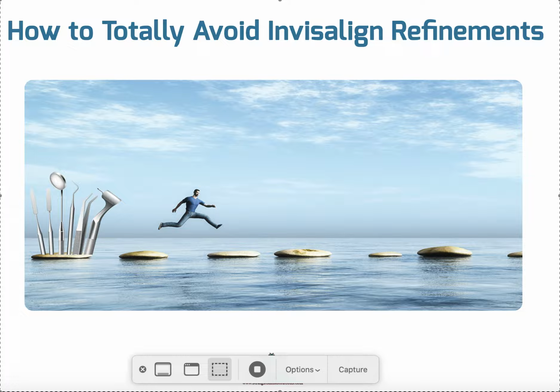And I use the same analogy with aligners, okay? So let me connect the dots here. The beauty of Invisalign Comprehensive or ClearCorrect Unlimited is that you can speed up to a point, or you can slow down the treatment plan within their own parameters. They have a lot of wiggle room within their own algorithms, within their own AI. They're going to give you an attempt, but I feel like most of their attempts are lowballing. I look at these attempts and very rarely do I think it's possible or predictable to do what they give me on the first round in the few aligners they give me.